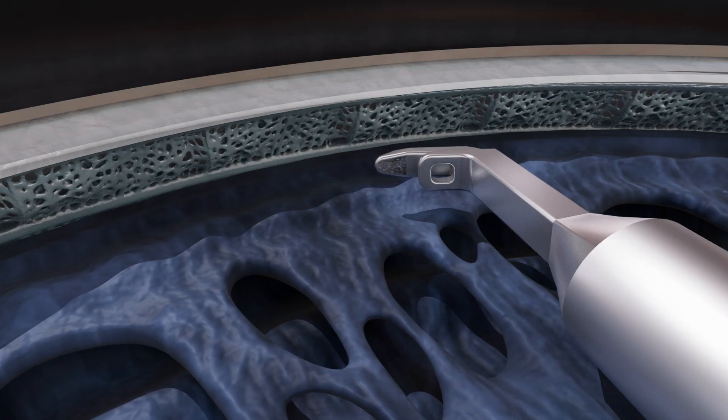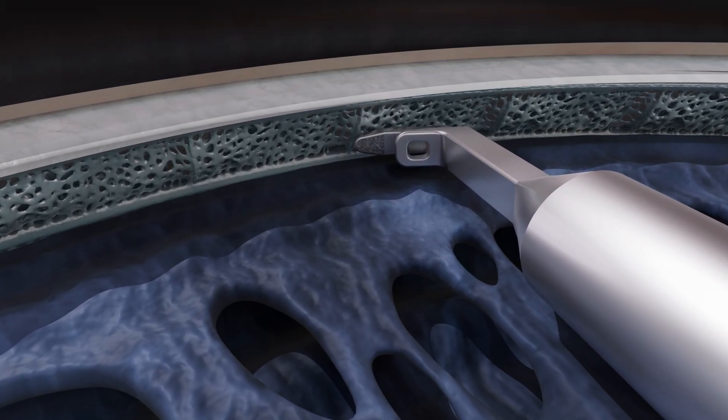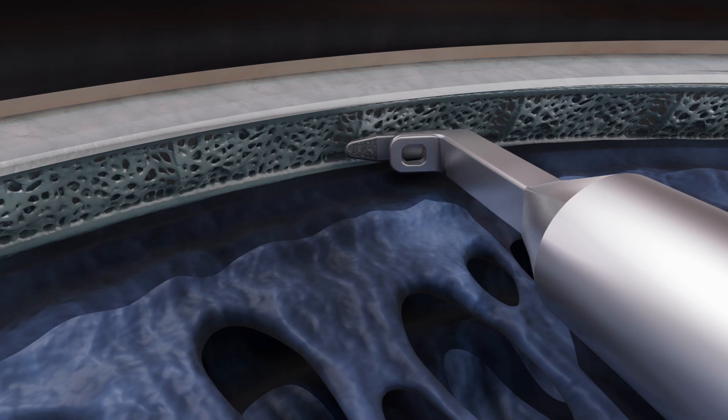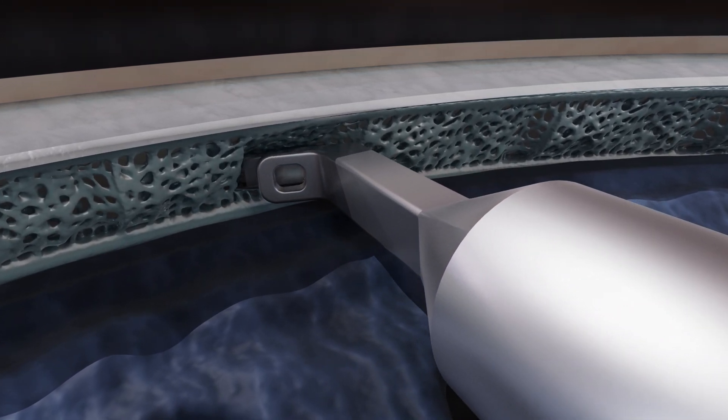From here, the trabecular meshwork is identified under gonioscopic visualization. Using the rounded toe to puncture the trabecular meshwork, the lower foot is advanced into Schlemm's canal.